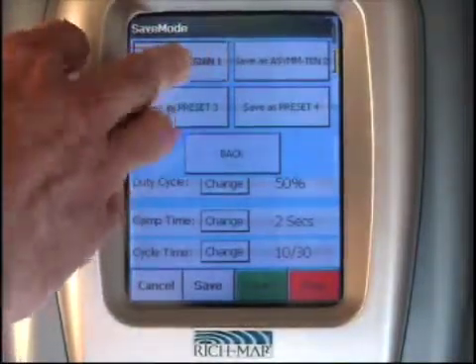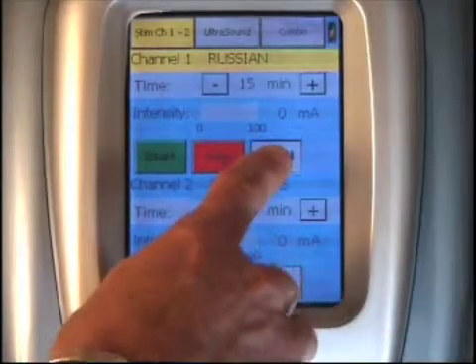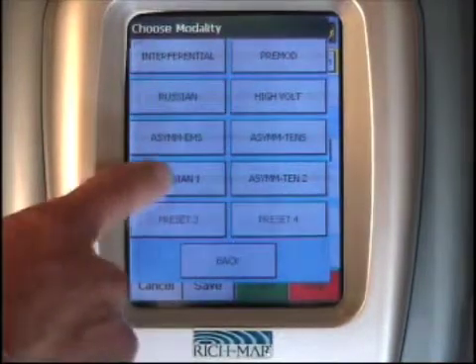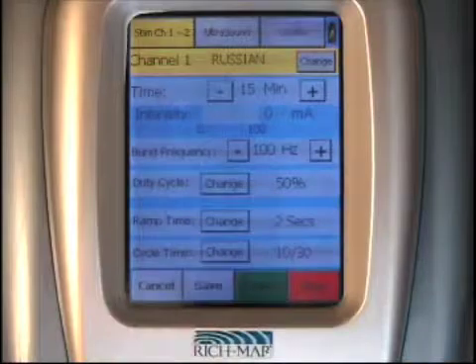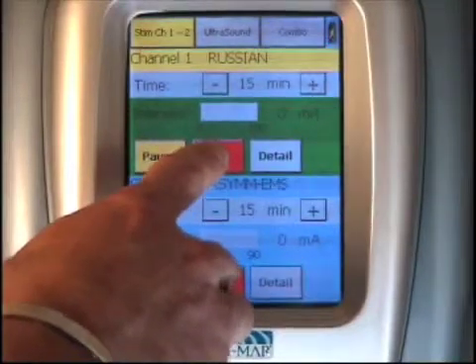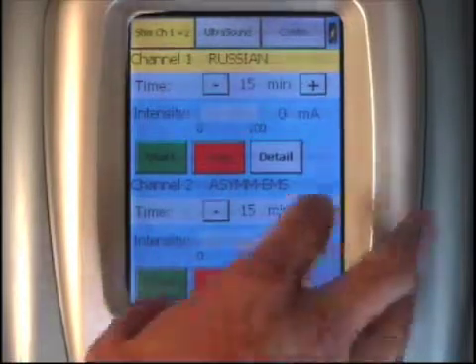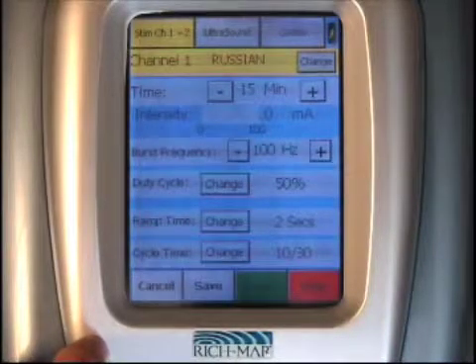We'll select preset one. Once you select this, it will contain the parameters you just ran. You then select start and the unit is ready to go instantaneously. The Sonic Stem unit always remembers the last treatment run by default. So when you want to change to a different modality, you simply depress the detail button, select the modality of your choice or the preset, and the unit is ready to run.